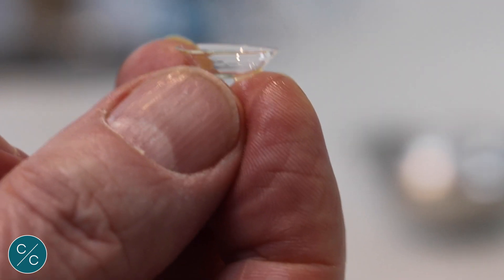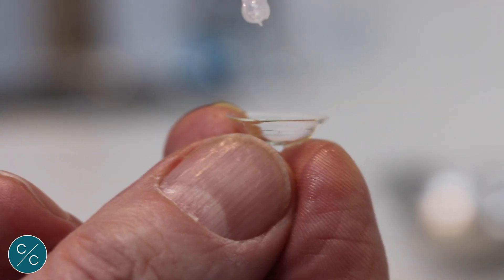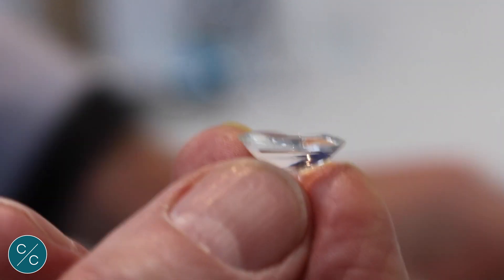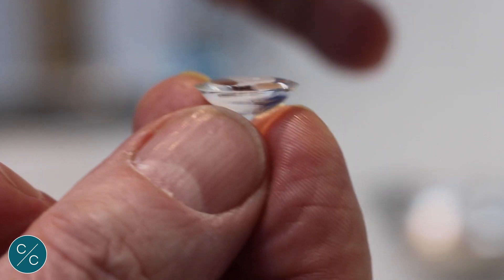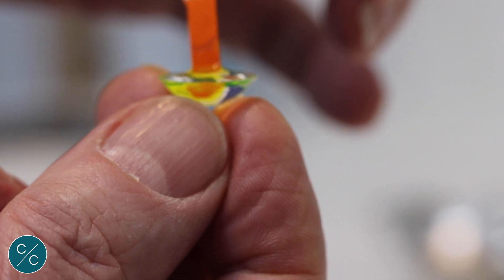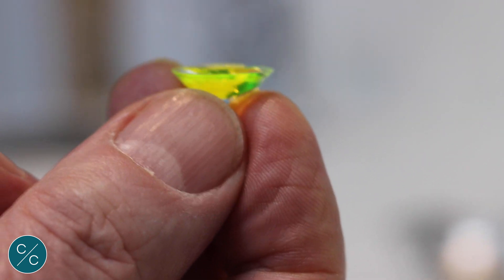So we take our lens, fill to overflowing with saline, take our Fluorescein strip and introduce Fluorescein into the bowl of the lens, and we're ready to go.